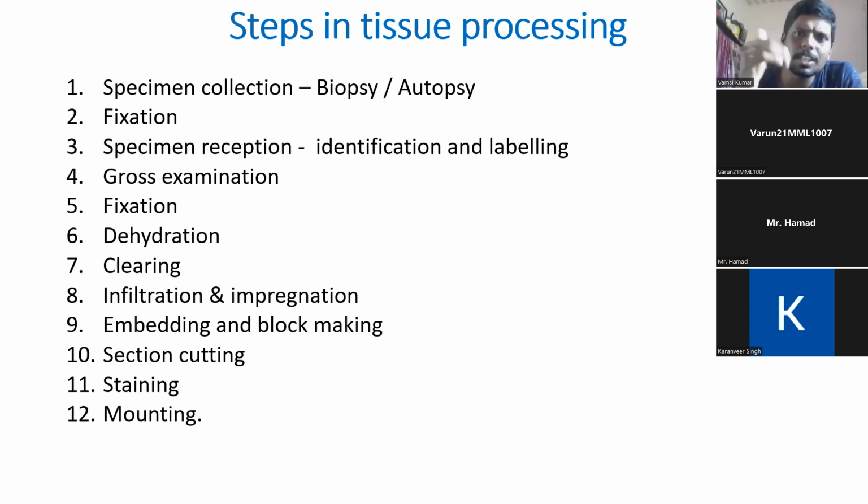And also we need to ensure that the patient's name, age, sex, referring physician, physician address, location, time of sample collection, everything needs to be there. If any data is missing, at any cost, we should not process these samples. Unidentified, incomplete, improper samples should not be processed. If you feel any sympathy or kindness, thinking the patient is dying and I need to do the test, then you will end up in legal proceedings, because it is a very delicate process.